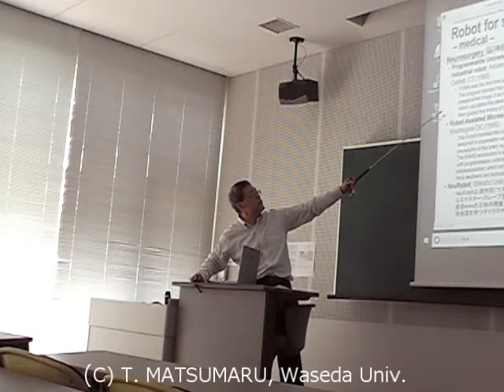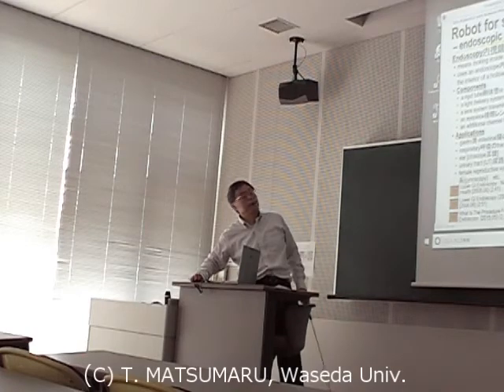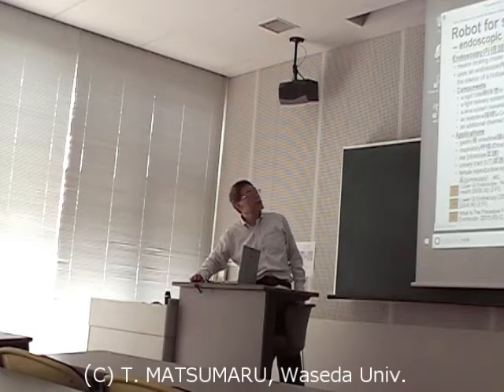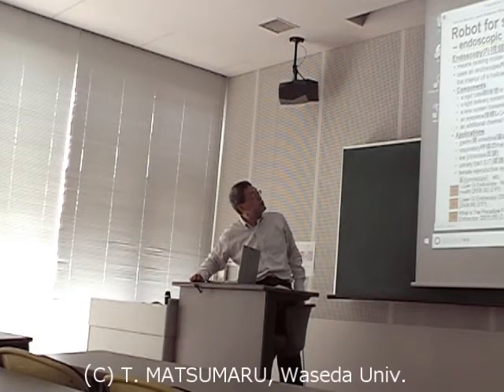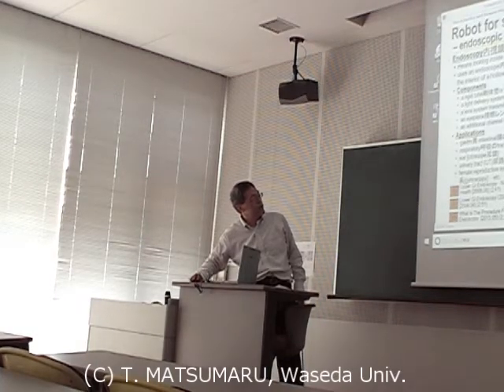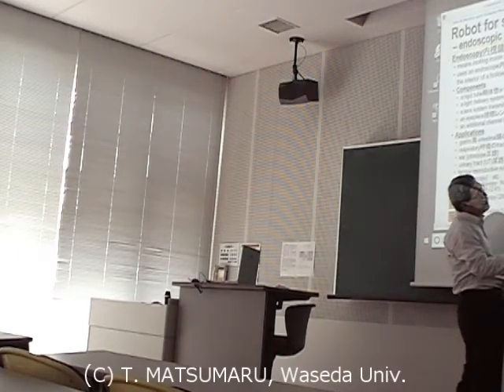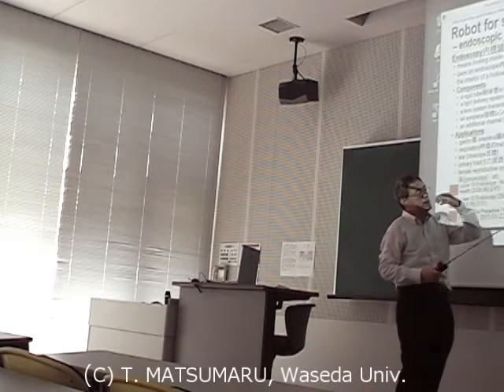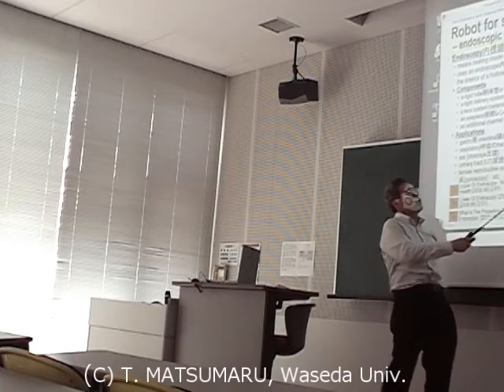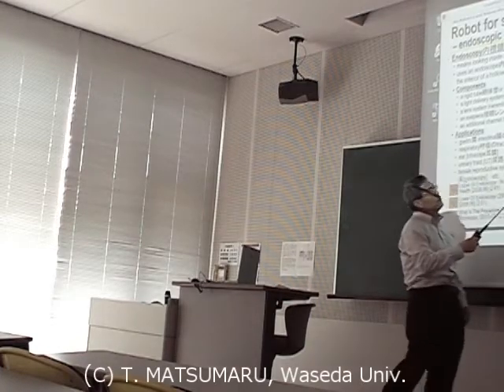で、次、next part is neurosurgery で、ちょっとこれはスキップしましょう。次はエンドスコープね。エンドスコープって you know エンドスコープ？ファイバースコープ、firstly it was ファイバースコープで、このドクター is watching this endoscope lens, and then this part is inserted inside the body through the mouth or through the lower part, and this part here is watching.